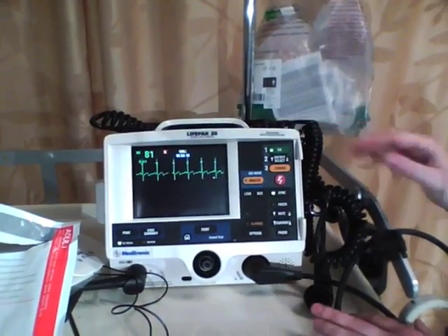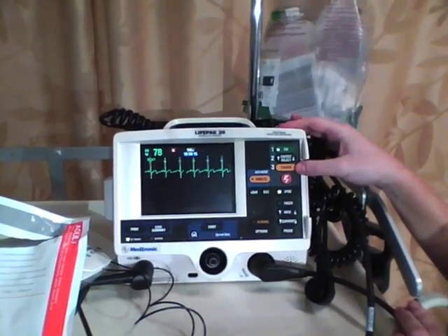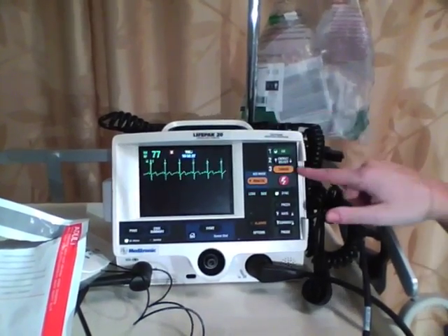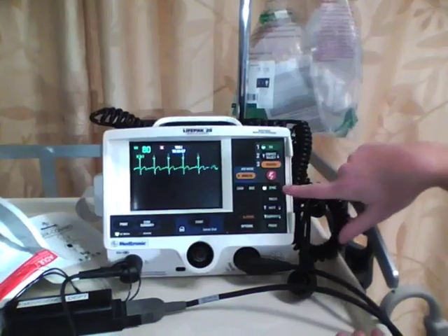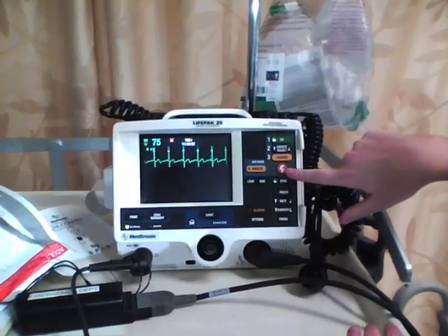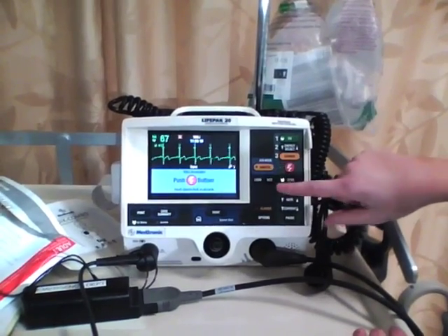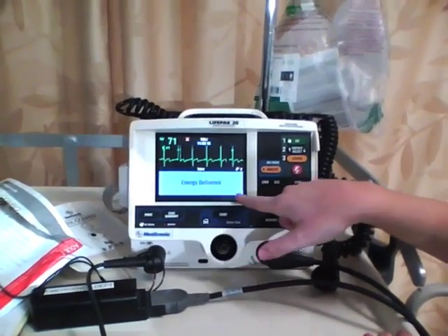We have our energy selected. Once the patient and the doctor are ready, press the charge button. Then make sure that everybody is clear — nobody is touching the patient or any metal. So if we're all ready: I'm clear, you're clear, everybody's clear — press charge, then press this button here to deliver the shock. Make sure you hold it in to deliver the charge. Press charge, everybody's ready, everybody's clear, hold this button in, and then you know it worked because the energy is delivered.